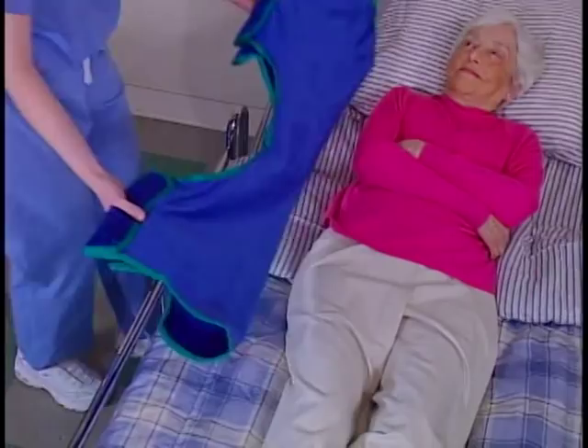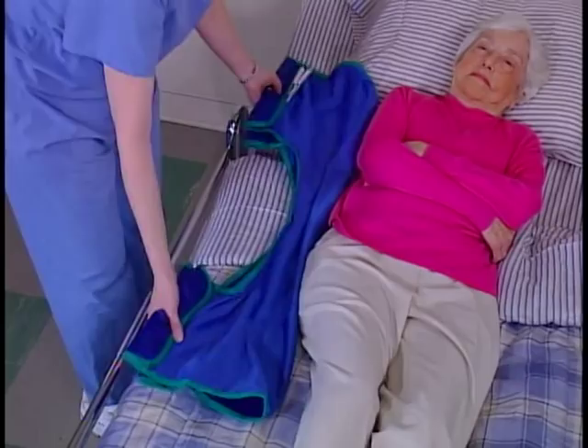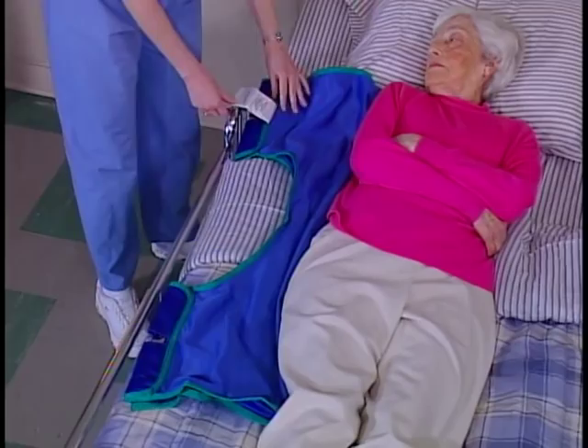Position the sling next to the resident. Fold the sling in half lengthwise so that the smooth side is against itself and the bindings are on the outside. The bottom edge should be just above the resident's knees and the top edge should be slightly above the armpits.